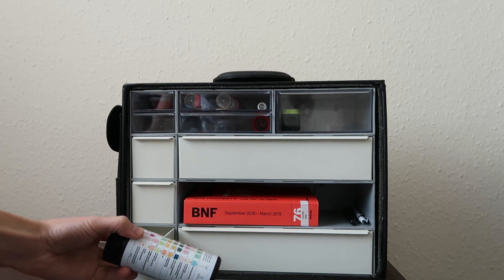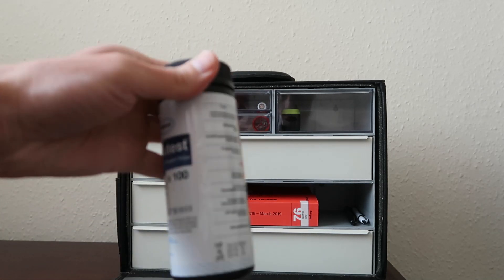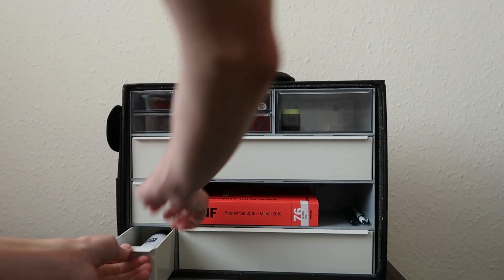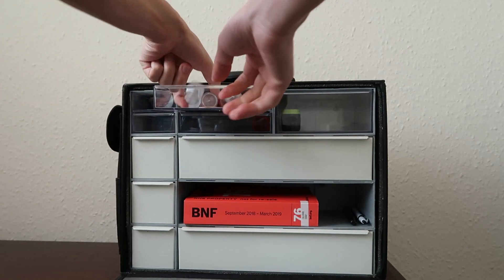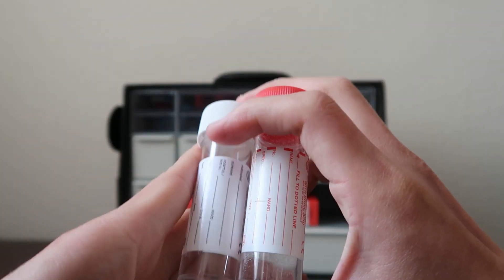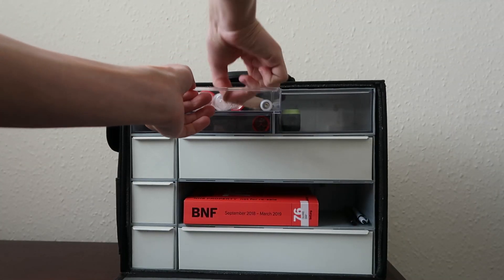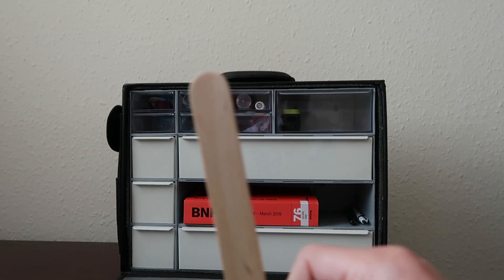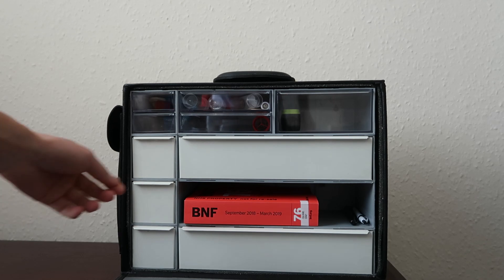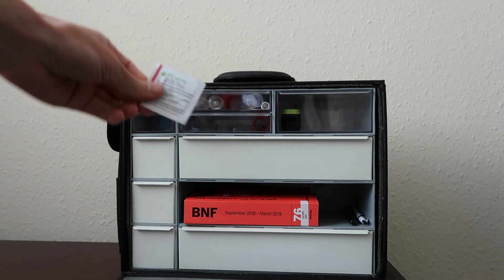This is a urine dipstick, just in case if you need to carry out a quick dipstick on a home visit. Here are some sample bottles that are handy to carry. And then a tongue depressor. I also carry some wipes.